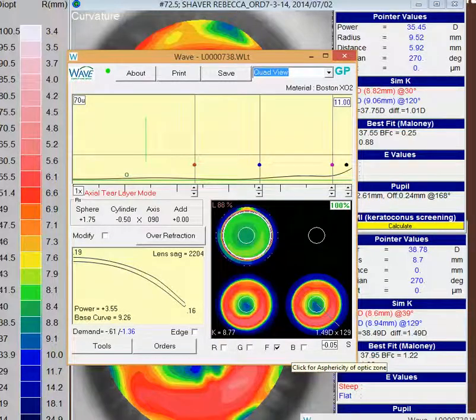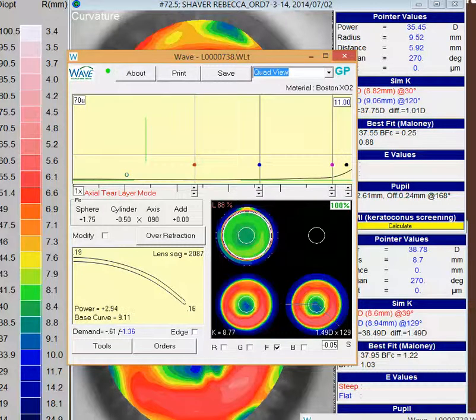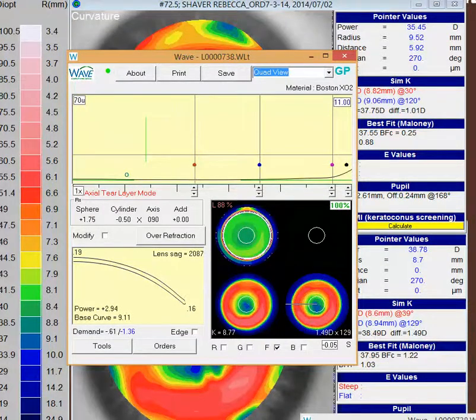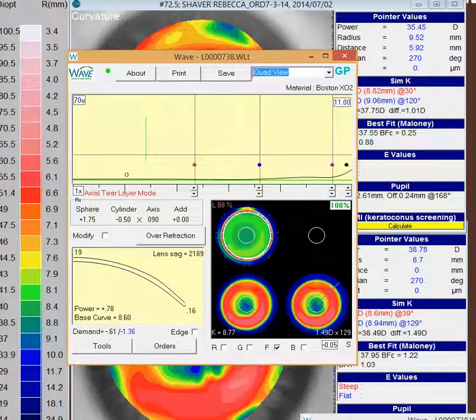I clicked on free form, and I put a little back asphericity in the minus .05, and let Wave design the lens. And you see we had a little back surface of this lens that very closely mimics the topography. And I would expect this lens to do reasonably well in this patient.